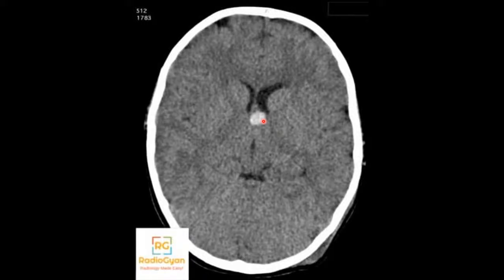A differential that Dr. Suman rightly mentioned is SEGA, that is a subependymal giant cell astrocytoma. Commonly we see that in tuberous sclerosis patients. There'll be additional findings, but long-term stability would be against that of SEGA, but that's also a common location for SEGA.